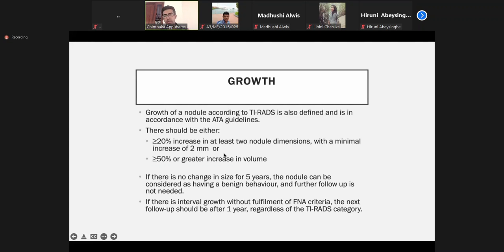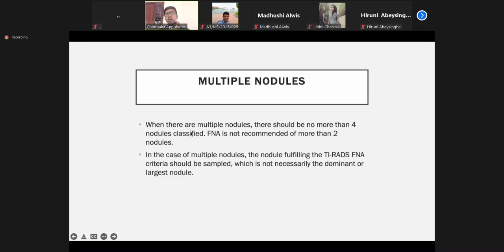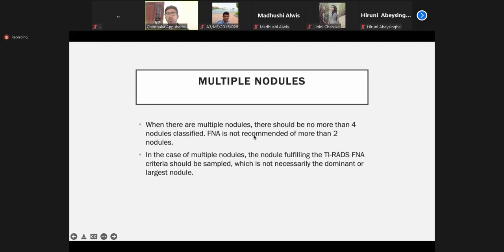Growth doesn't directly come into the scoring, but when you see rapid interval change, you need to do further evaluation because rapid growth or interval size increment is a suspicious feature. In our routine practice we see a lot of multinodular goiters. In multinodular goiters, we don't sample all the nodules — we go for the two main lesions, either by size or appearance. By classification, we narrow down to two nodules and evaluate. When doing FNAC, we don't do FNAC from all nodules — we go for the most suspicious two.